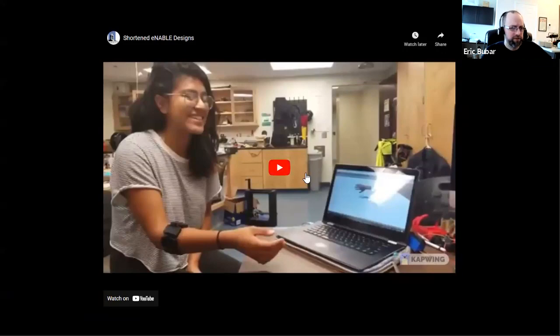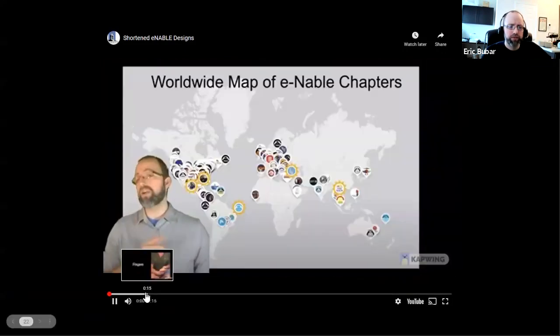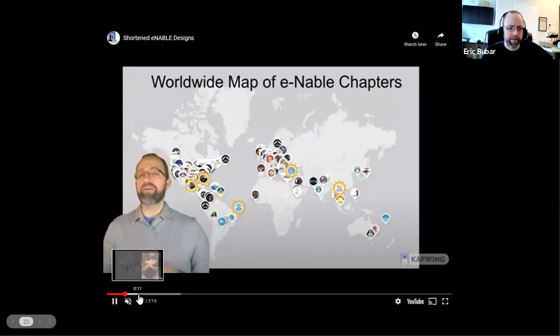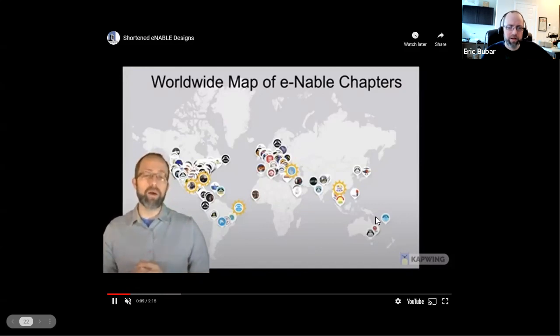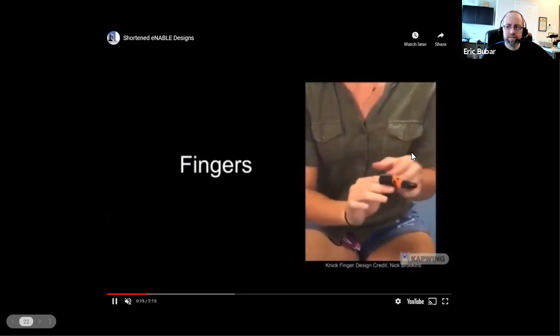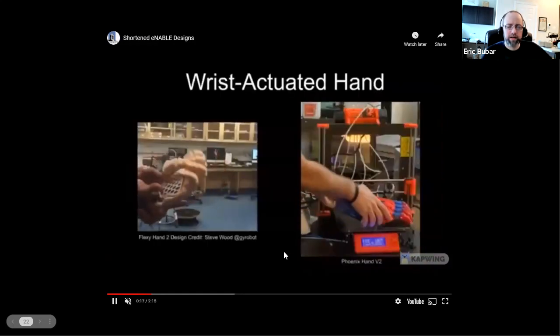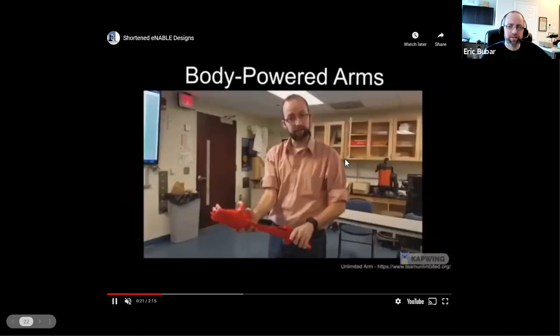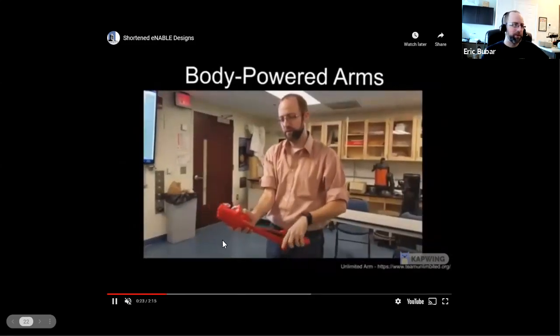So what we've got now is just a brief little video that will walk us through some of these designs that we have available. So here's our global map of all the volunteers. This is recent as of last year. You can see we do finger designs. So this is the Nick finger created by a gentleman named Nick Brooks. This is the flexi hand made with flexible filament. There's the Phoenix hand. Here's the body powered arm.